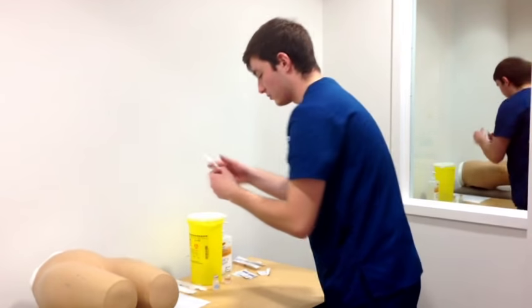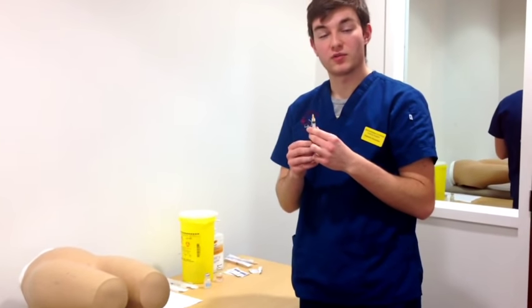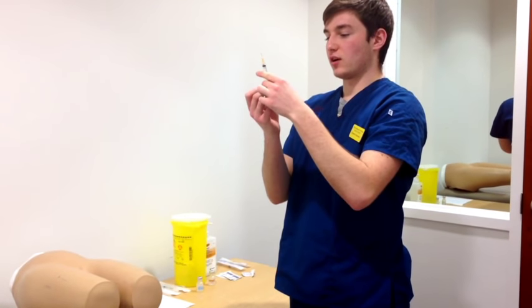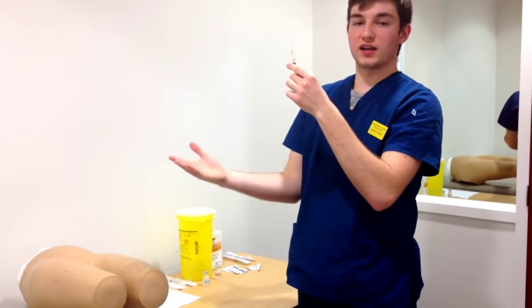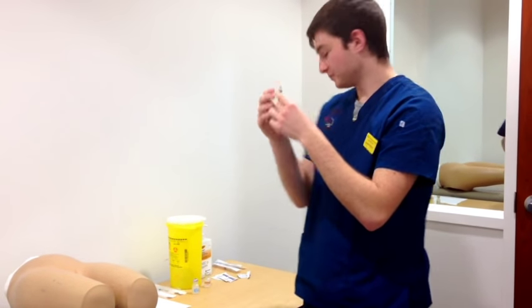First off, I'll be doing the subcutaneous injection. Based on my calculations, I need 1 milliliter of medication from this vial. So I will draw back 1 milliliter of air, making sure not to put my finger on the plunger itself. In the case of high-alert medication, you just want to have another nurse in to double check the medication.